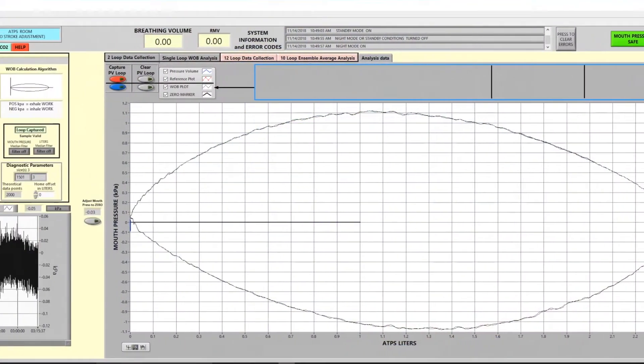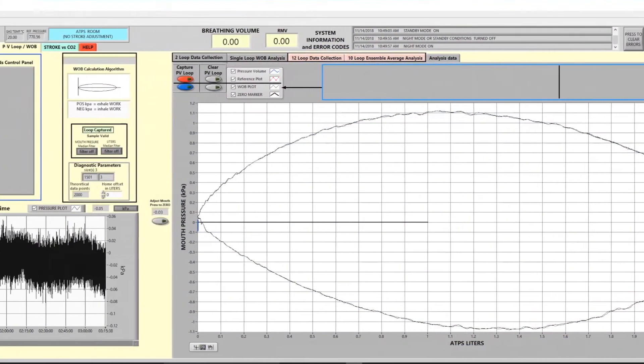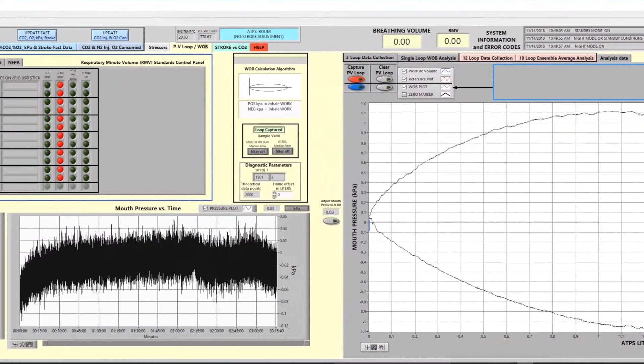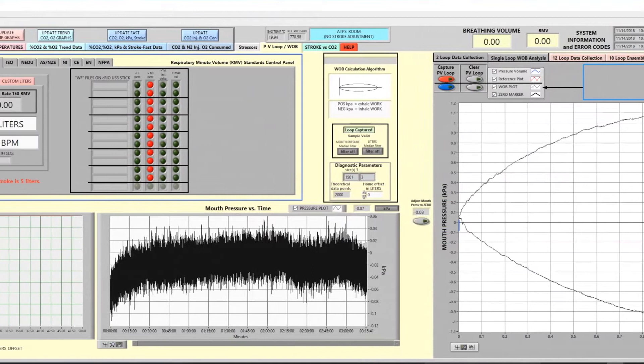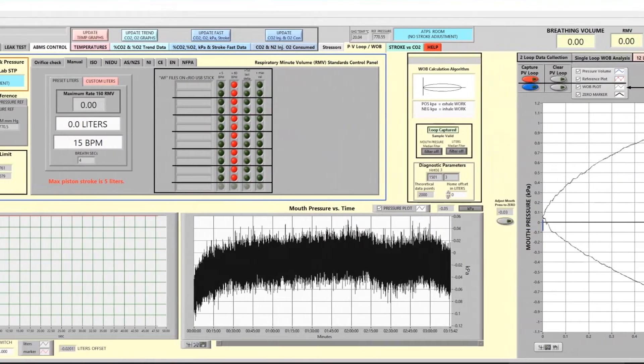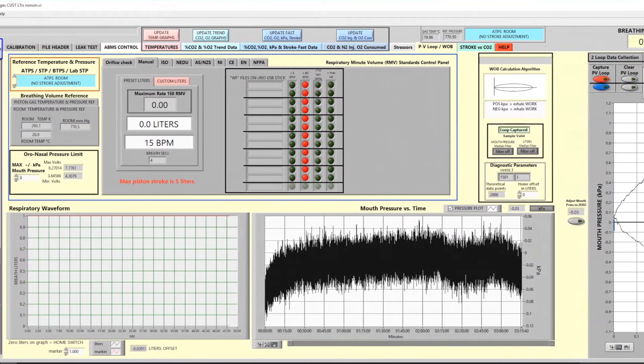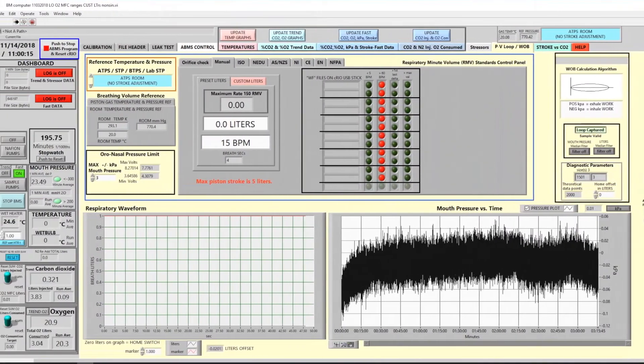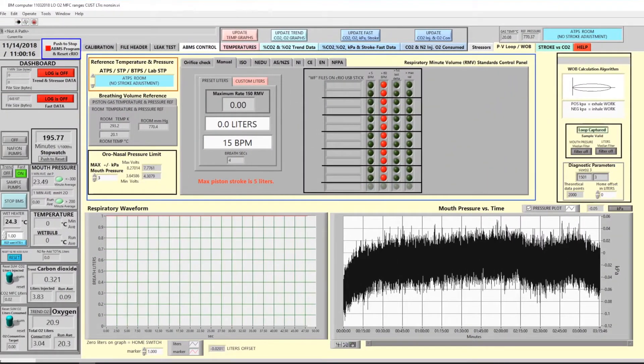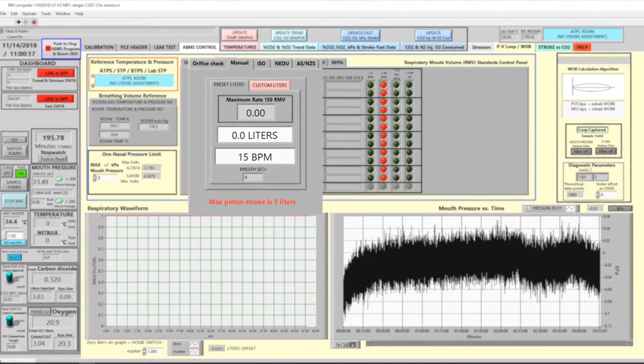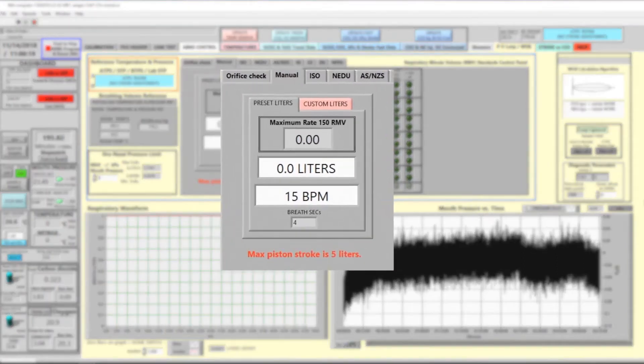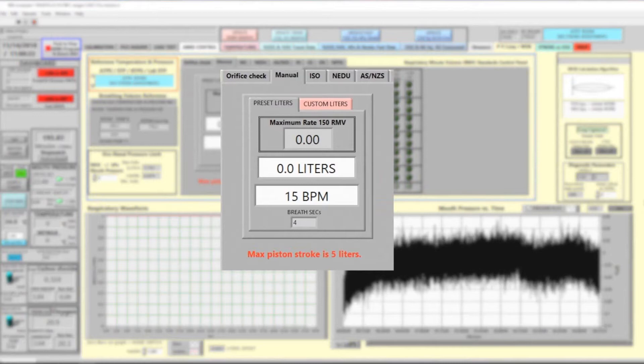One of the primary functions is to evaluate the work or effort it takes to breathe a respiratory protective device. On this screen, you can select different respiratory rates in order to simulate a human resting or working as hard as a man can do.